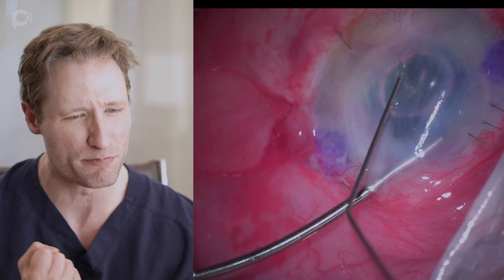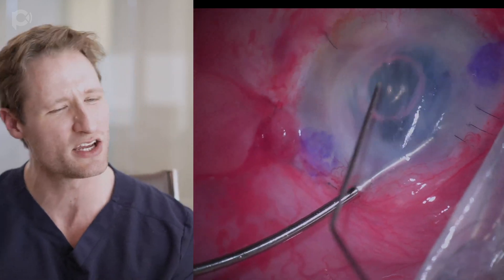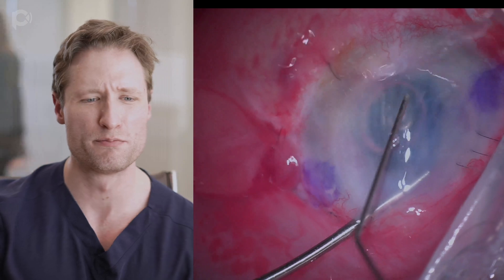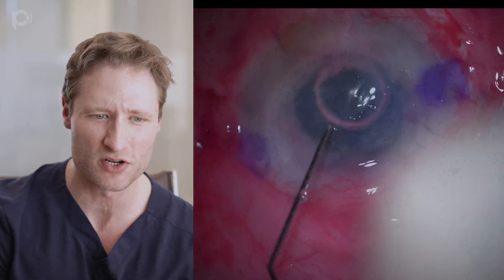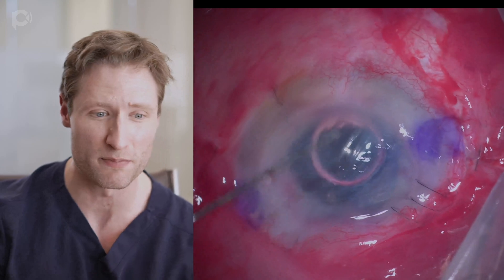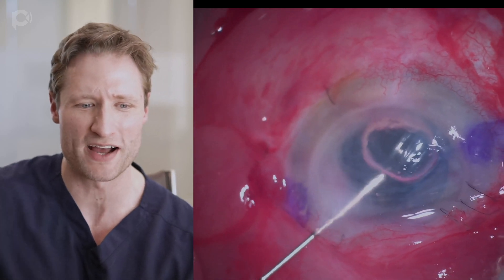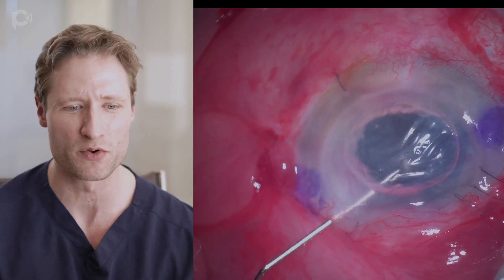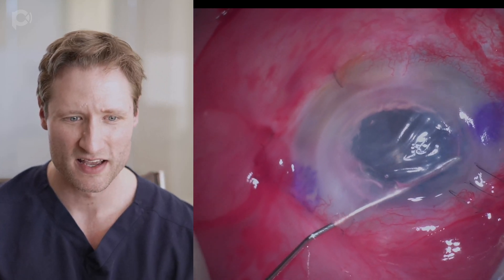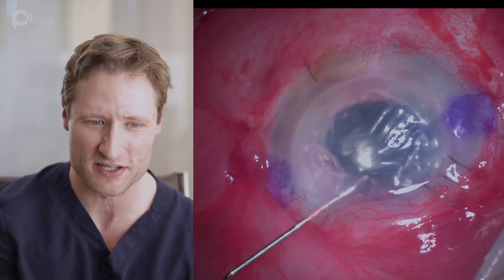This is my last attempt to grab and move the graft up higher. I fiddle with it just a bit before giving up, because if the graft is stuck so firmly that it will not move in response to pulling, it is more likely to attach and work if you leave it alone than force it into a position where it doesn't want to be. It's totally unfolded on the back of the cornea, so rather than push the issue and force a bad situation, I stop and fully inflate the anterior chamber with the air bubble.